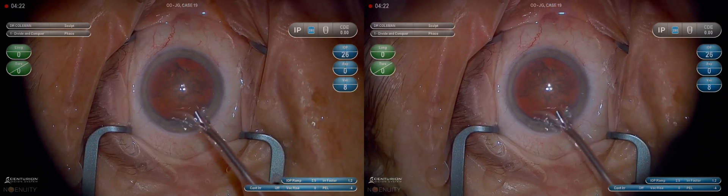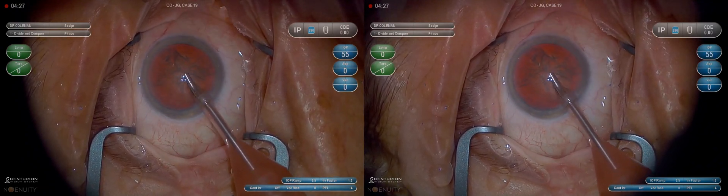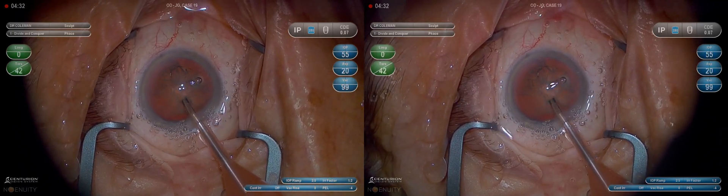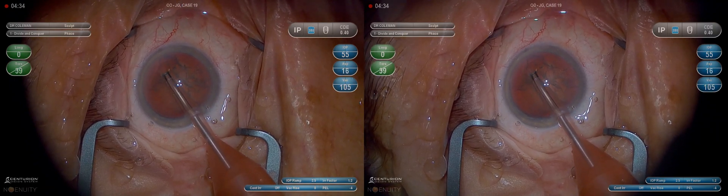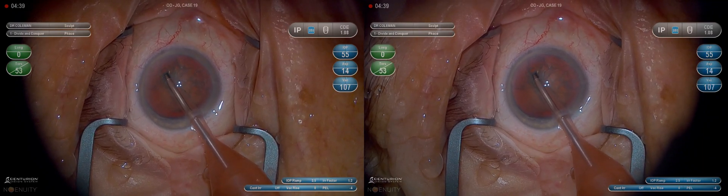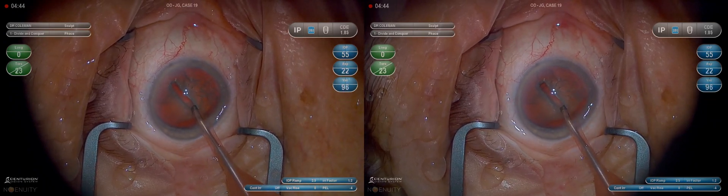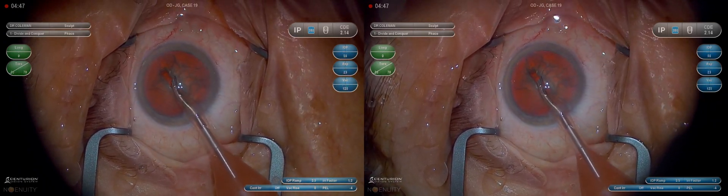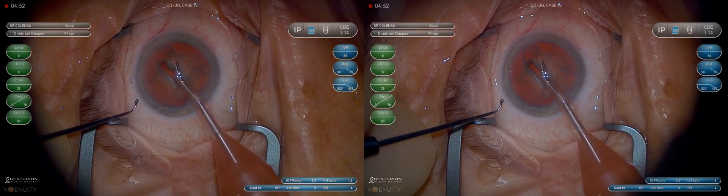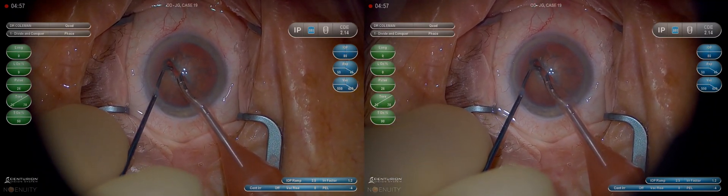I use a divide and conquer technique on probably 95% of my cases. It works on almost every density of lens. I'm going to use a groove and crack method. The lens is on average 3.5 to 5 millimeters thick, probably closer to 5 on most people who have a dense cataract. The tip is about 1.2 millimeters, so we get three passes when we groove before we have to worry about the possibility of grooving through the posterior capsule. So you don't have to be timid on the first three passes — they can really be full-thickness passes. Then we want to slow down and be careful on those last few.